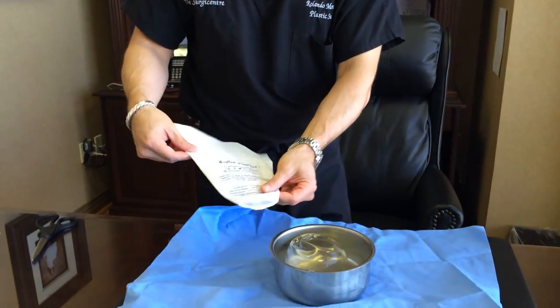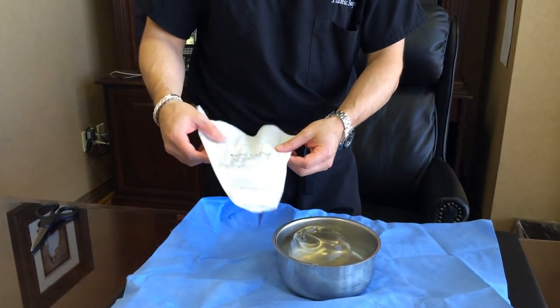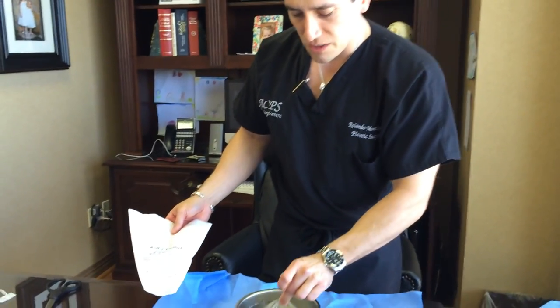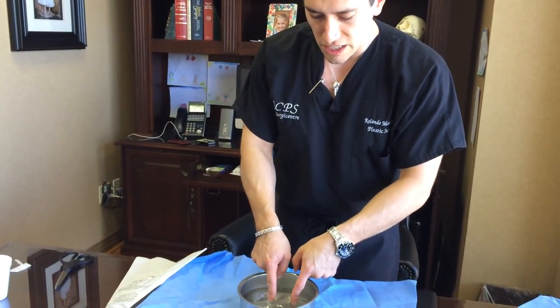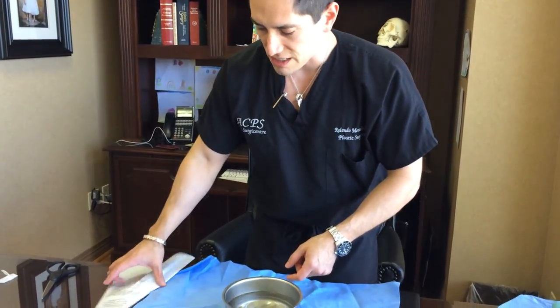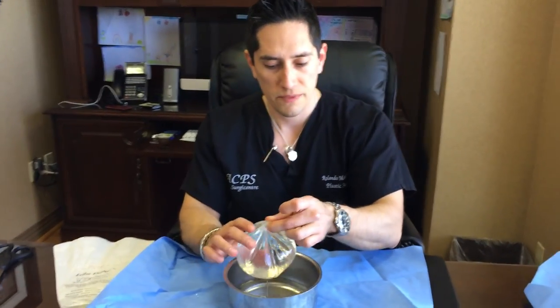This funnel is used only one time, so it's done for both sides, and then this is thrown away. The implant's within the body, and then I can adjust and make sure the position's correct. But the process is a lot less stressful on me, and a lot less stressful on the implant itself.